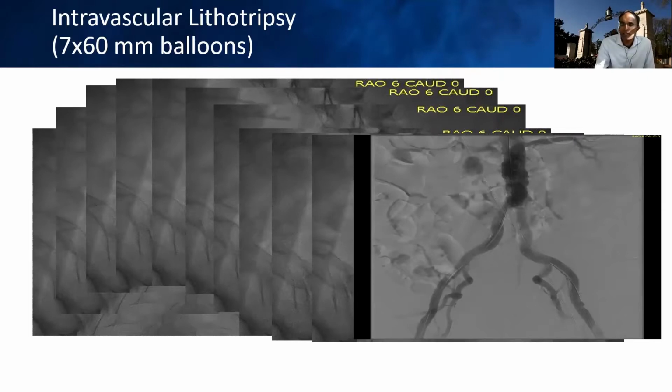Occasionally you may see a low-grade dissection as you would see in balloon treatment alone. We'll typically leave those alone unless there's any evidence that it's propagating or flow limiting, but that's typically rare at low pressure, and as it was in this case.